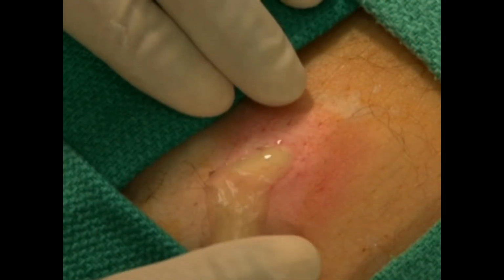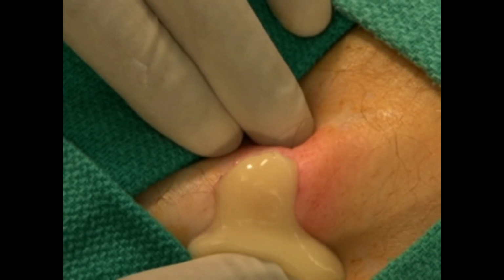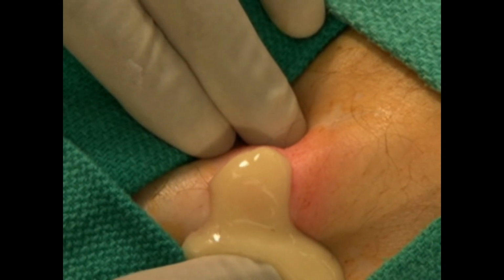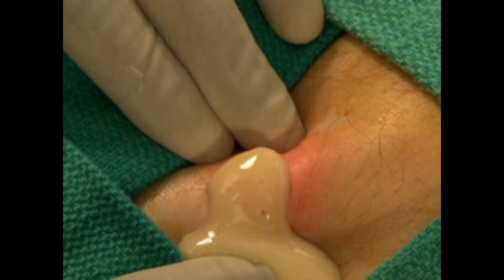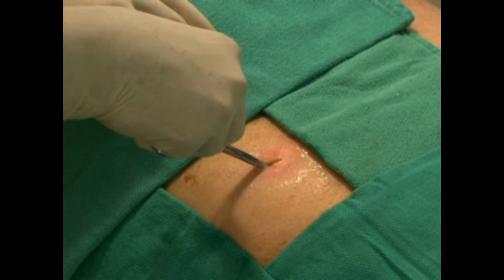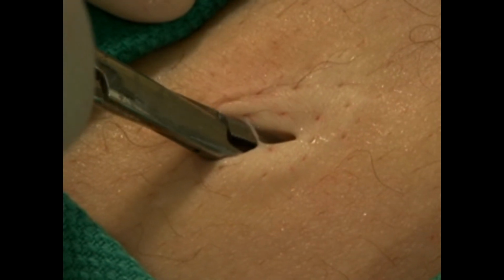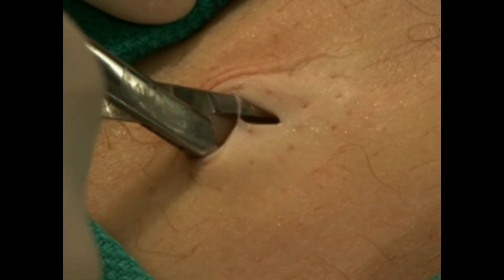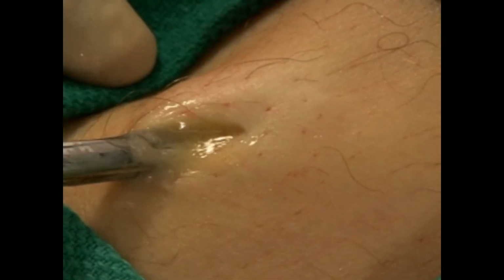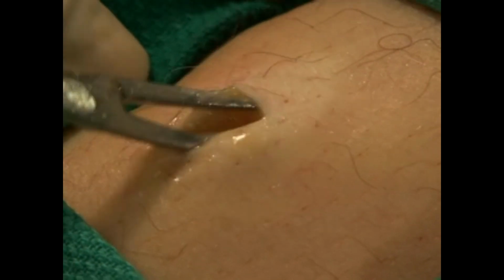After allowing the wound to drain spontaneously, gently express any further contents. Additional injections of local anesthetic may be helpful during this portion of the procedure if there is significant patient discomfort. Use a curved hemostat for further blunt dissection to break loculations and allow the abscess cavity to be completely opened up. Insert the hemostat into the wound until you feel the resistance of normal tissue, then open the hemostat to perform blunt dissection of the internal portion of the abscess cavity.